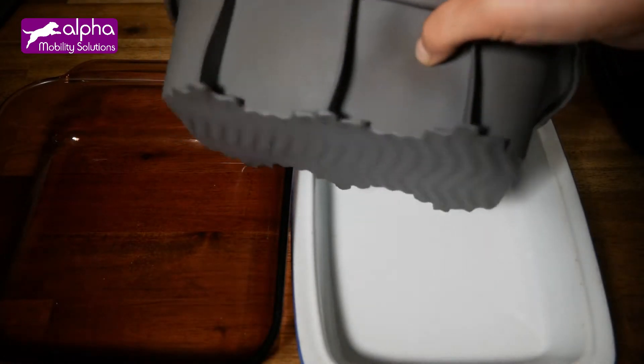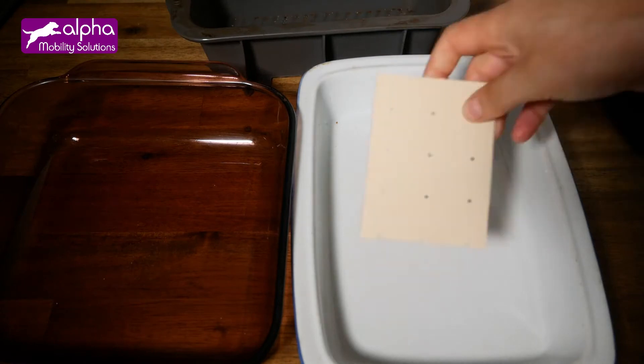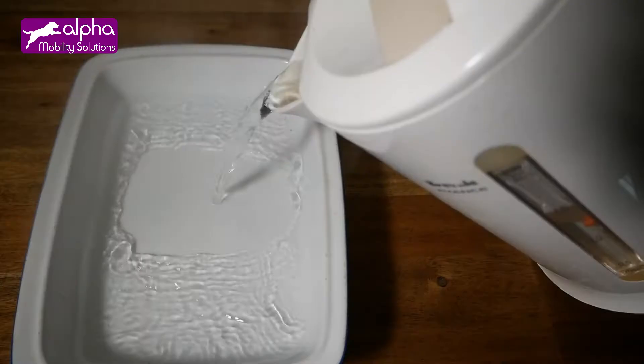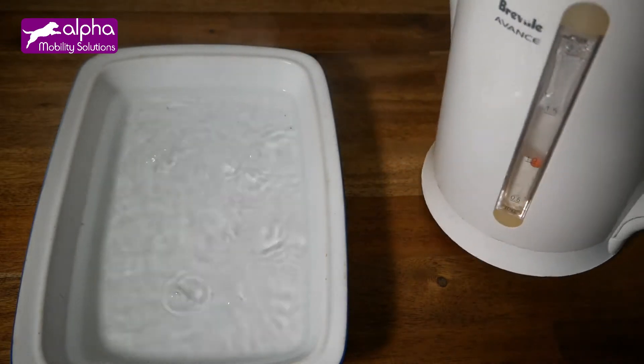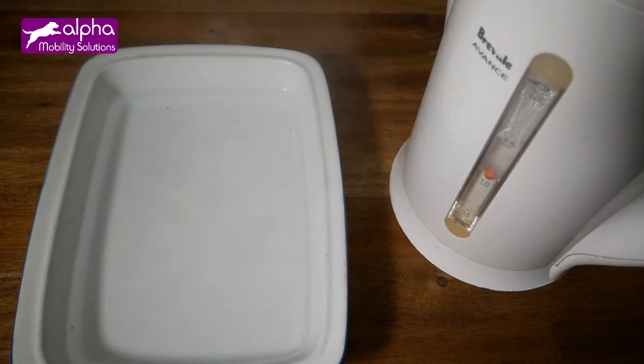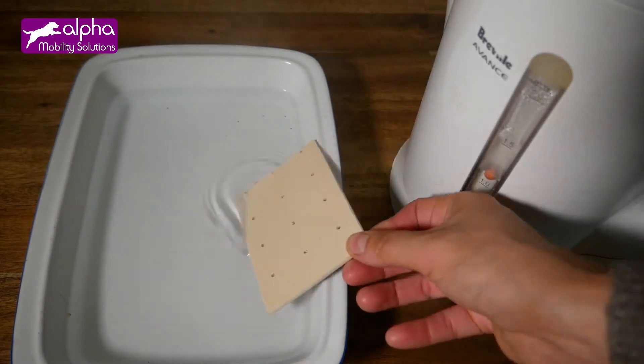Use any oven dish — one that is large enough to contain the size of the sheet. Pour hot water into it and soak the sheet for two to three minutes. The temperature must be at least 71 degrees Celsius. If you use boiling water, be careful not to burn yourself.